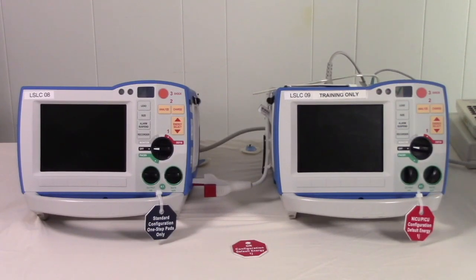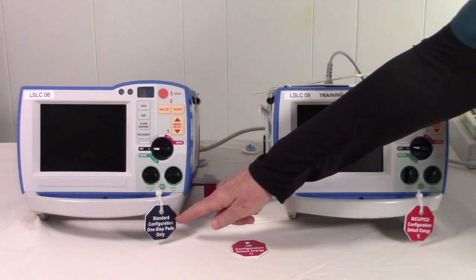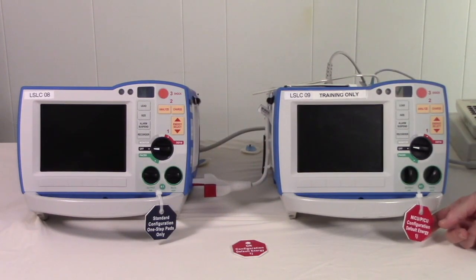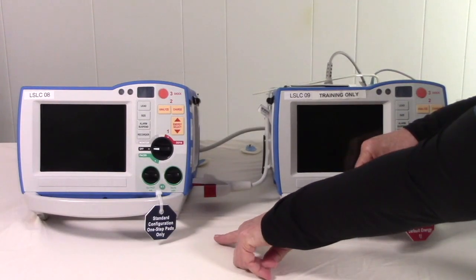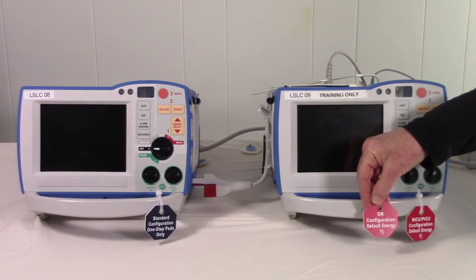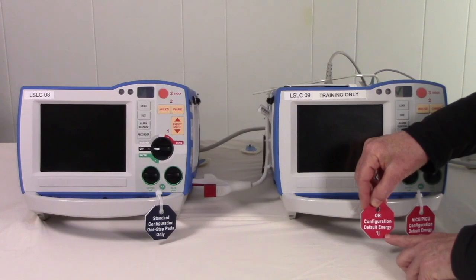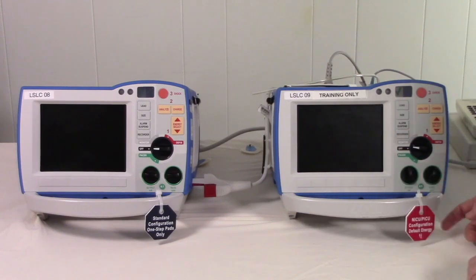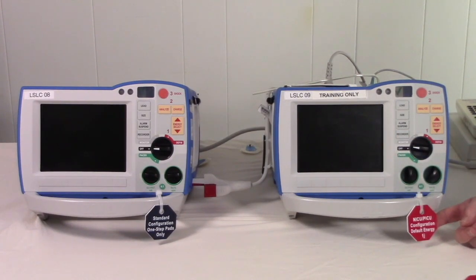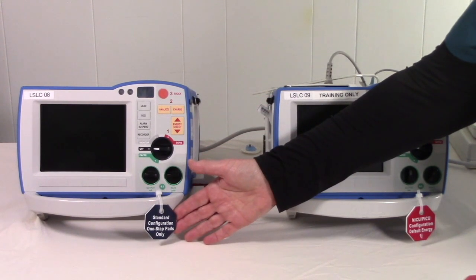Let's briefly overview the Zoll R-Series. There's basically one device configured in two different ways, and the configuration has to do with the energy default. You'll notice there are two different colors — red and blue — and three different names on the tags. The two red ones both default to one joule energy selection. You'll find these in the OR, neonatal ICU, and pediatric ICU. The standard configuration is found in other units with the Zoll R-Series.